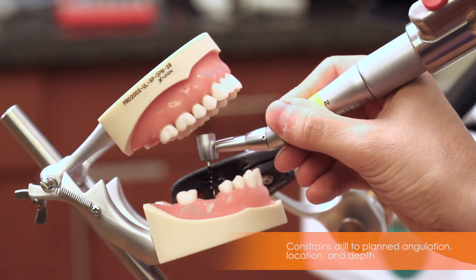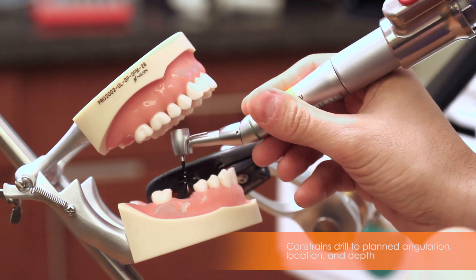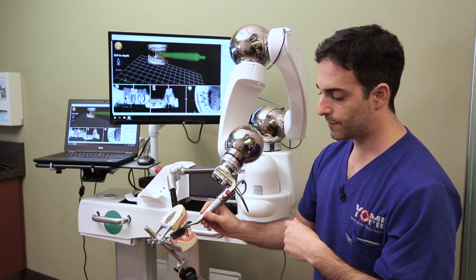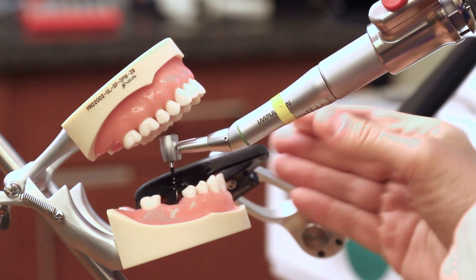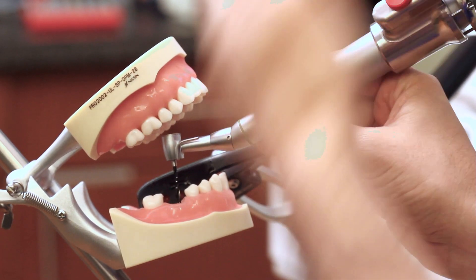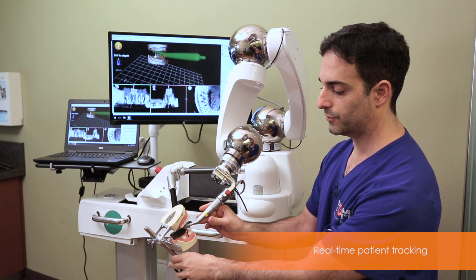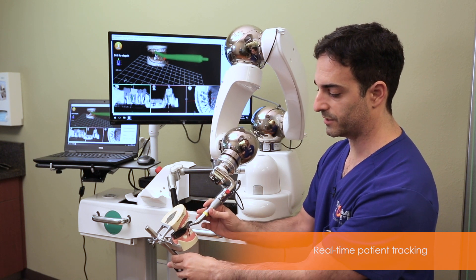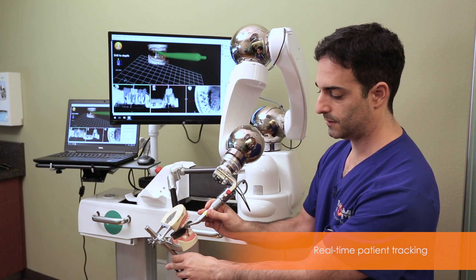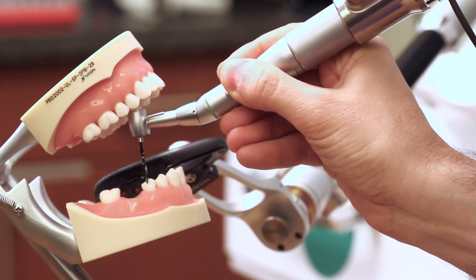At this point, I would drill down, complete the osteotomy, and then back out. And you'll notice if I let go, the system will only rotate about the axis, but it won't ever change position or angle — it'll stick with the planned trajectory. If I move the patient, you can see the drill will always follow with the patient motion. And when I complete the osteotomy, I keep pulling back and it lets me into free mode.